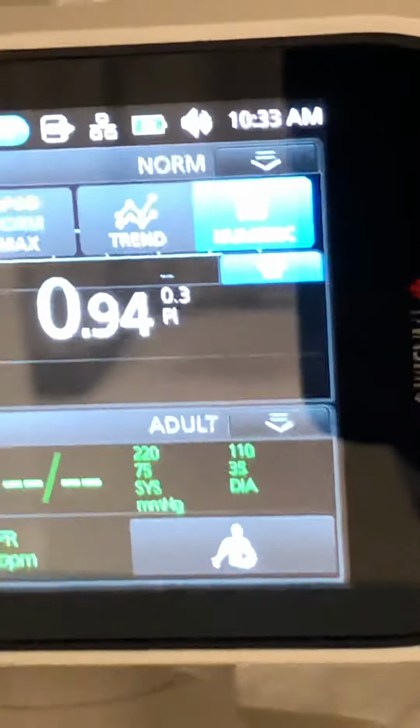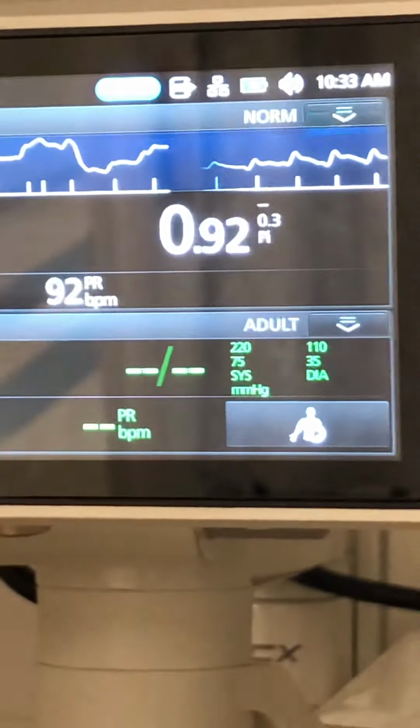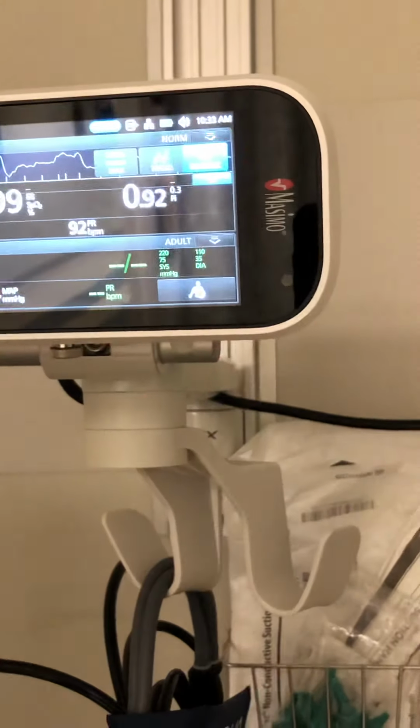In order to adjust it, there's a little caret there. The third box over, you'll see what we call APOD, norm, and max. APOD stands for adaptive probe-off detection. It's a mode specifically designed for that of an OR. You guys aren't going to use that.